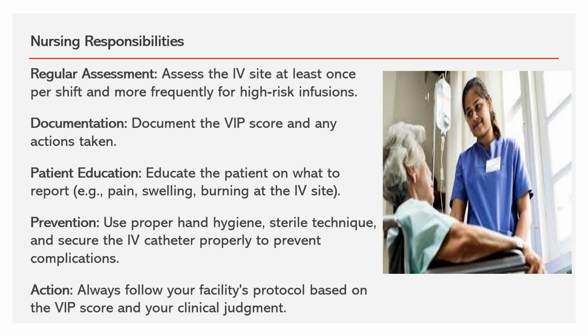If it is moving, there is a chance the IV cannula will get swelling and it will not be usable. We can't use it. So today morning we inserted an IV cannula. By afternoon if the IV cannula is out, we are not able to use it, swelling came. That means we are not taking proper care of the cannula. And we should educate the patient also on these things.